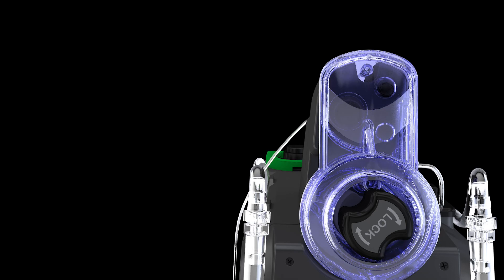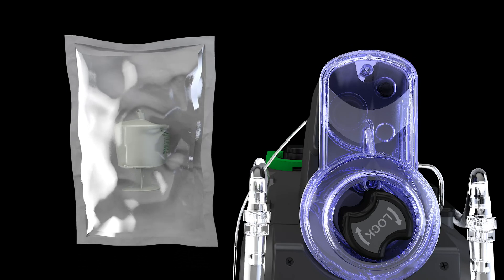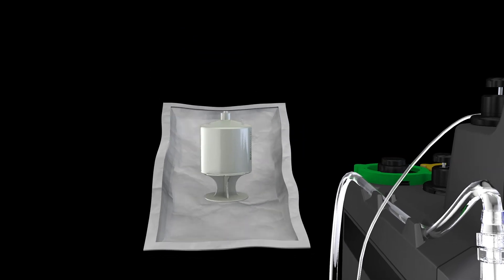Next, pick up sterile package containing the green additive cartridge. With the angled seal in hand, slowly peel open. Take cartridge out of packaging while maintaining sterility.